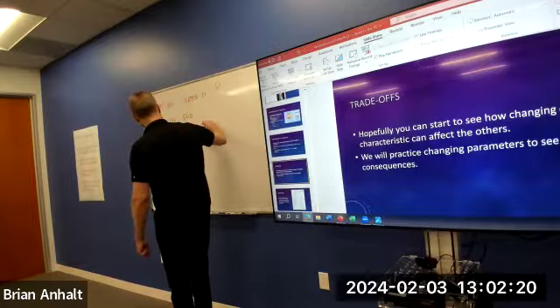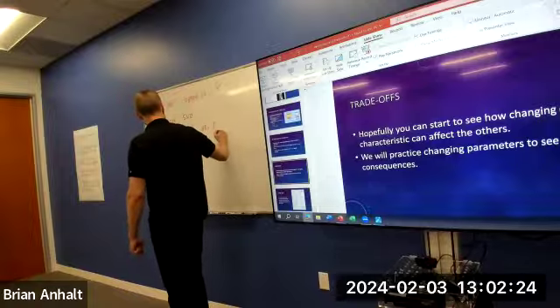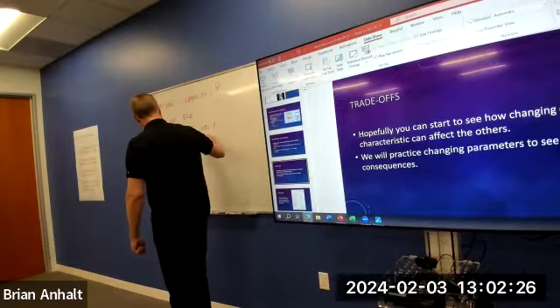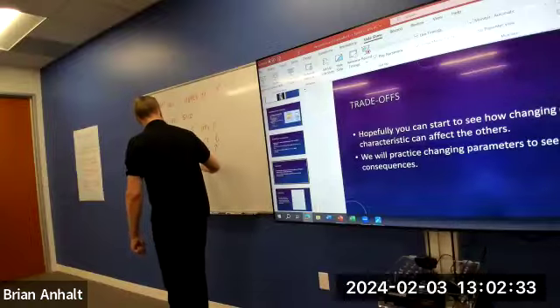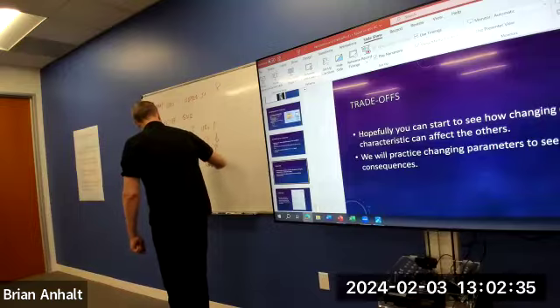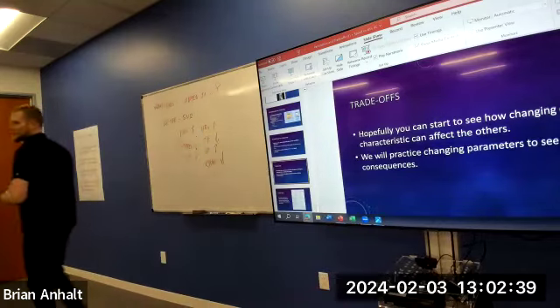What about next? Increase. What else can I do? Lower bandwidth. Yep. Lower TE. Higher TR. Receive bandwidth lower, right? A lot of stuff we can do there.